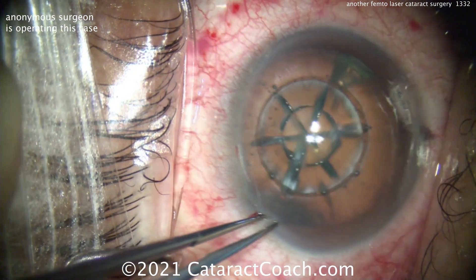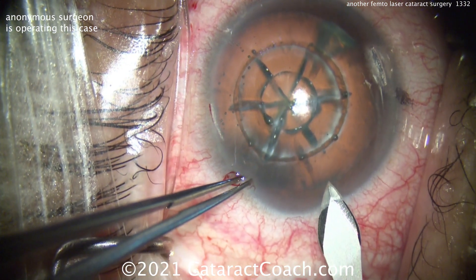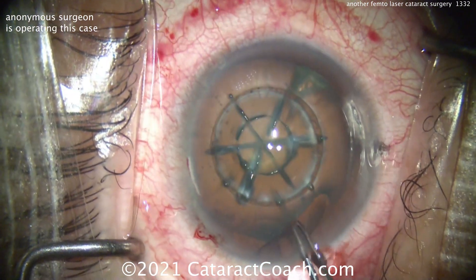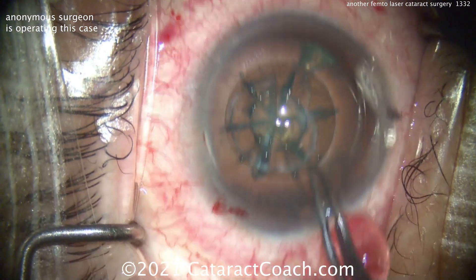Now here's the interesting part. Hold in the eye — and a steel keratome is being used to make that incision. Why not use the laser to make the incision? Well, the steel keratome may be able to make a better incision if the surgeon has great hands like you see in this video.